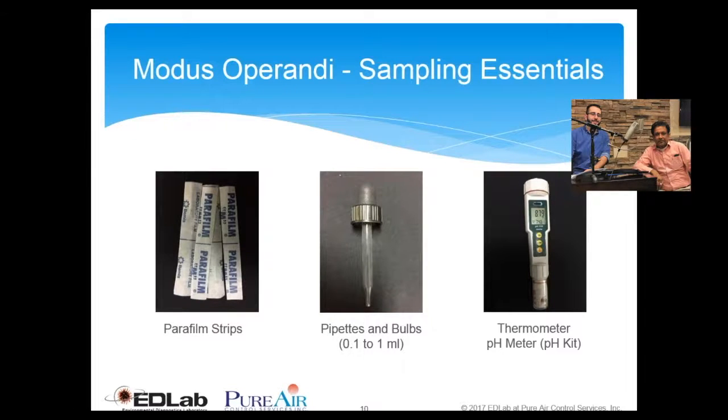Well, the other information which should be very valuable in the Legionella sampling is the amplification of other microbial entities in that particular water system. For example, if you have a greater count of heterotrophic bacteria in the water sample, chances of getting Legionella are great, otherwise not. So one can also collect the sample to do some heterotrophic bacteria count. The other thing that comes to my head is that if you have protozoa such as amoeba and stuff like that, then that is also a supporting factor for the Legionella growth.